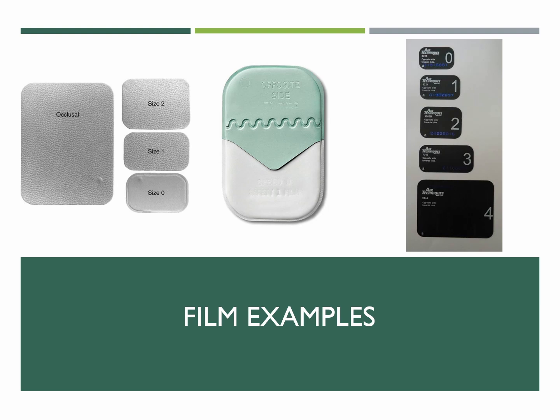On the film, you can actually see there's a dot. That dot is to go to the front of the mouth. And that dot helps because it shows up on the film when it's processed. It helps you locate. So that dot always goes to the front of the mouth, so you know that's the rostral aspect. So when you have all your films taken, you can realize which ones are at the front, which ones are at the back, and then you'll also learn about maxillary and mandibular.